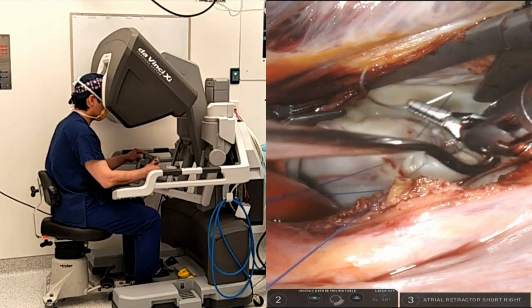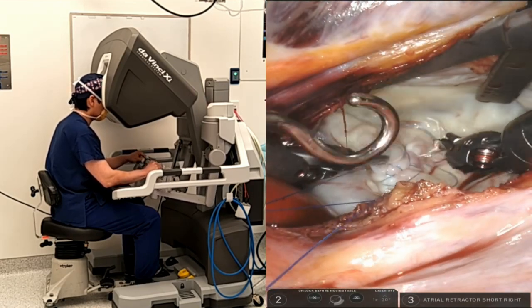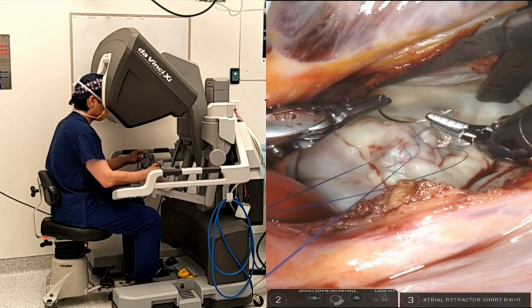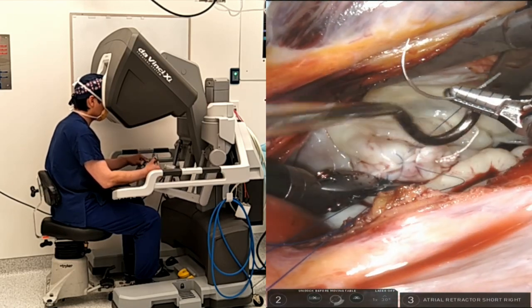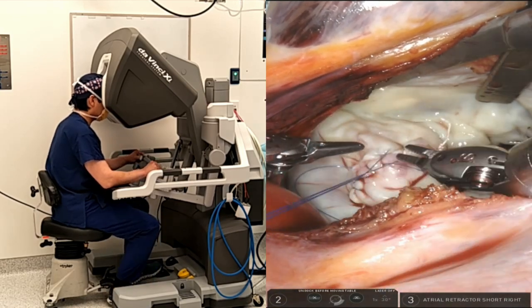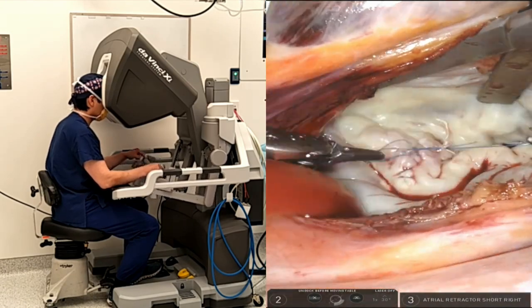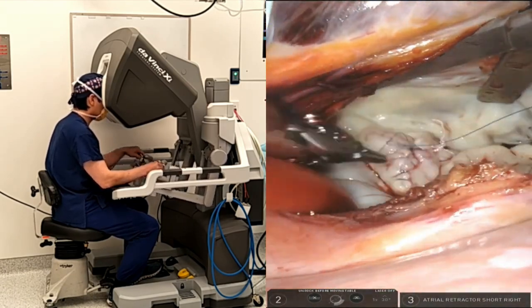I don't usually perform the saline injection test until the end. You may also use pre-measured neocords such as the Cordax loops, but I just find this method of cordal implantation quite simple, and the robotic instrument movements are predominantly in the left atrium rather than in the ventricle.